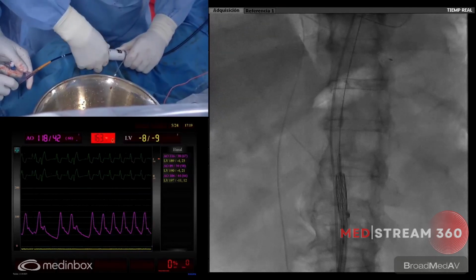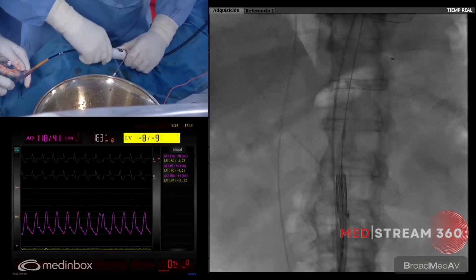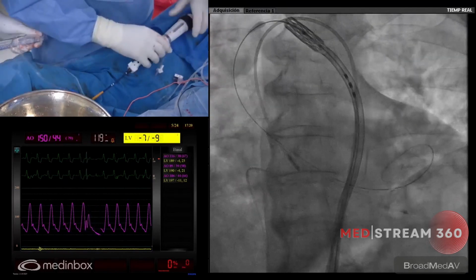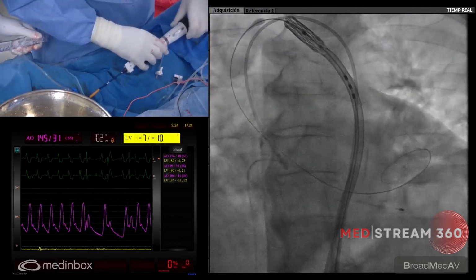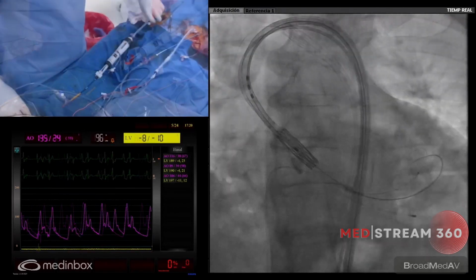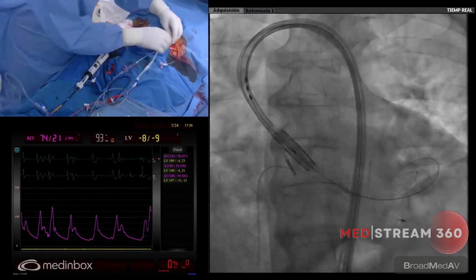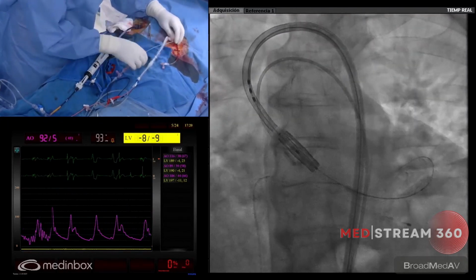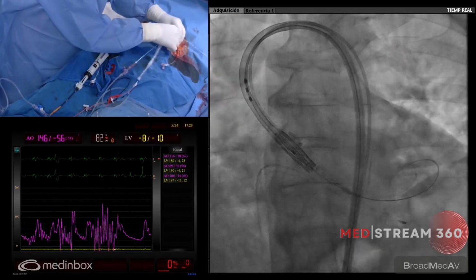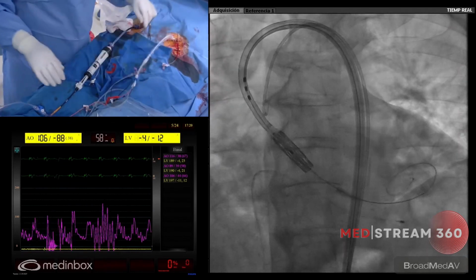The patient is so big that the image we have is not that good. The patient is too long, so we are going to deflect the catheter for the aortic arc, and we are almost in. Okay, we can wait there. We can reposition the pigtail, which I think is twisted with the valve. And I will need the Amplatz wire to go into the sinus.